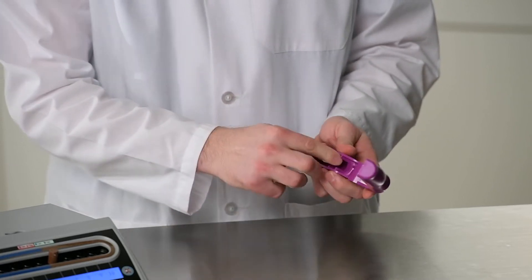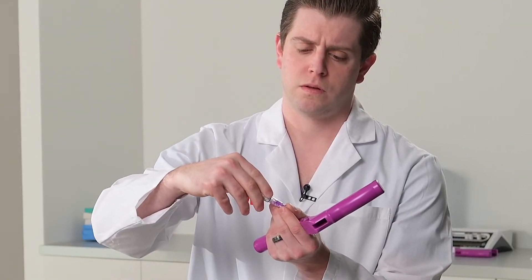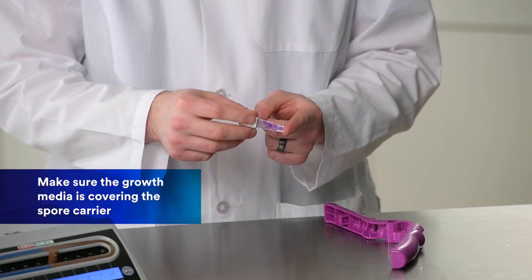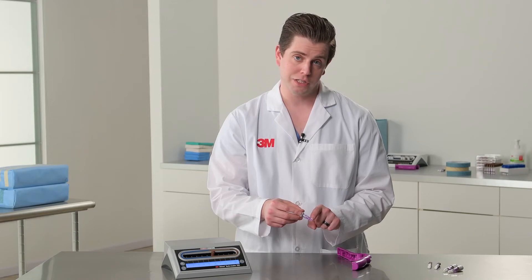You want to flick the biological indicator and then you want to inspect. Inspecting is an important part after flicking, as you want to make sure that the growth media is covering the spore carrier, which is located at the bottom of the biological indicator.